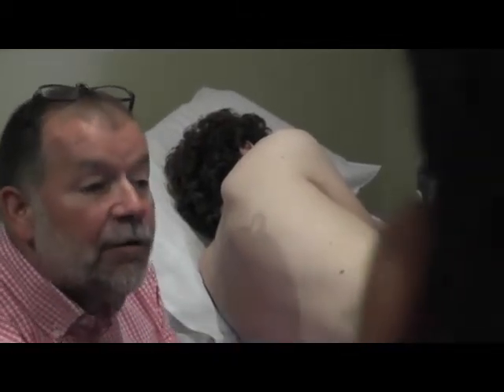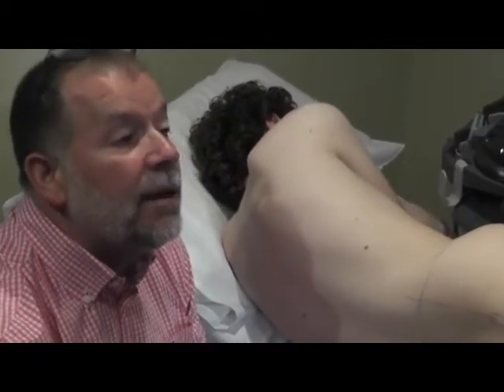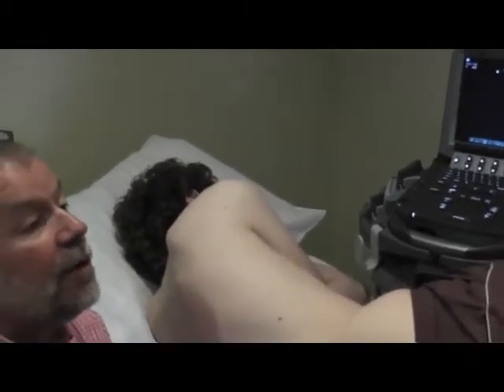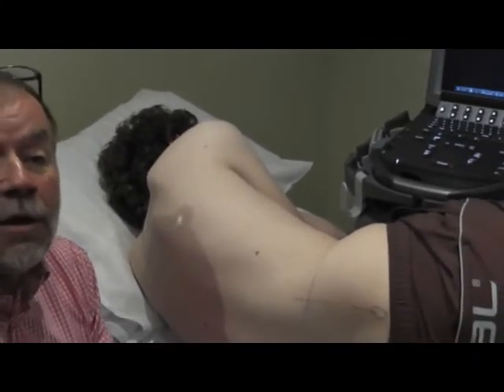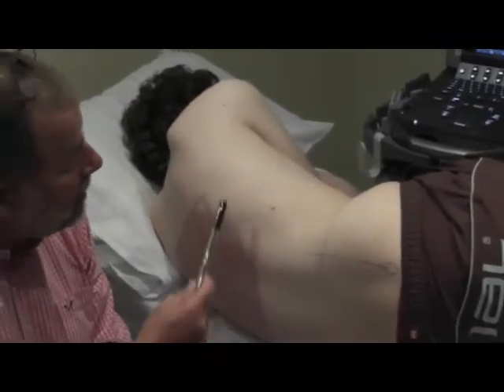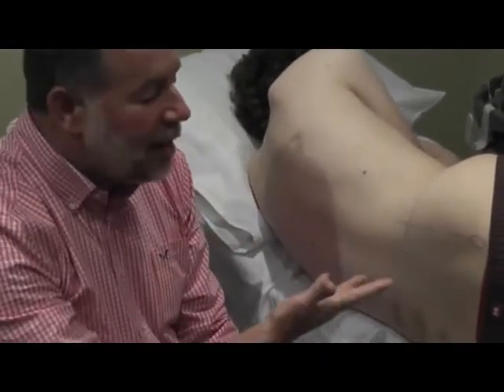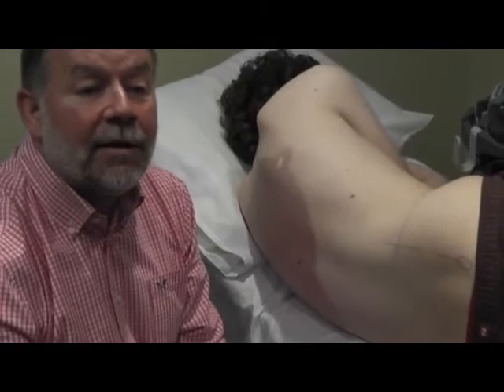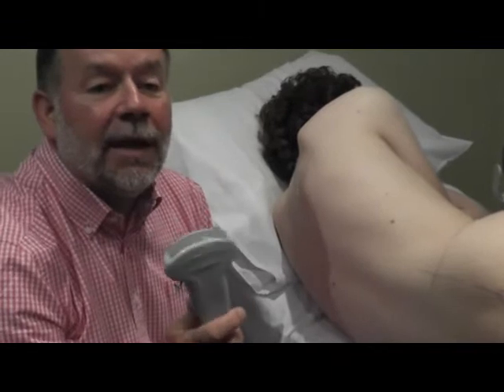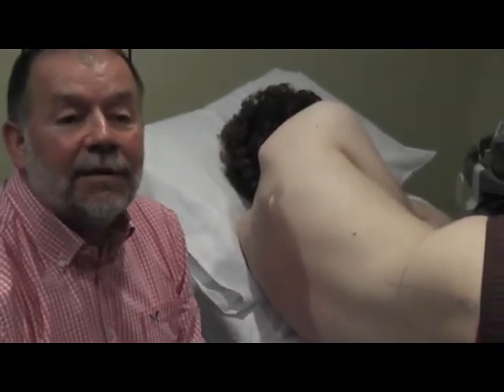So the nerves can go through different areas, and so again, if you look at the actual cross-section of the lumbar plexus, you'll find that the nerves can move between different areas of the muscles, and so it has a lot of anatomical variation. The problem we have with the lumbar plexus is that the interscalene is superficial. The lumbar plexus is deep, and our problem there is that we're looking at deep structures, and that's where this comes in. The problem with ultrasound is that it doesn't like 6 inches of fat.